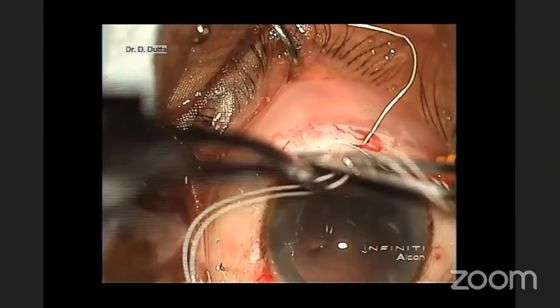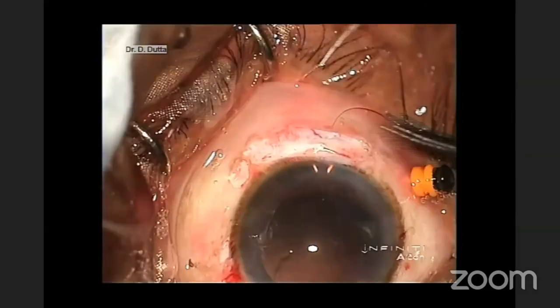What about the IOL? Oh yes, the multipiece IOL is placed in the bag.